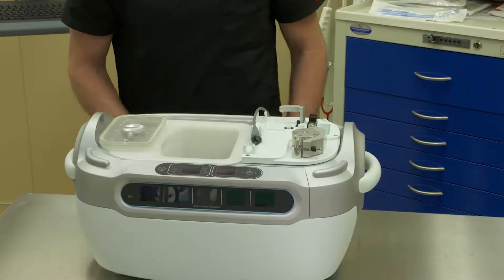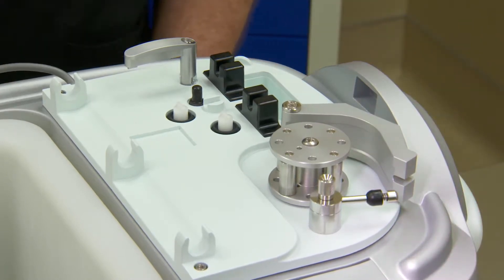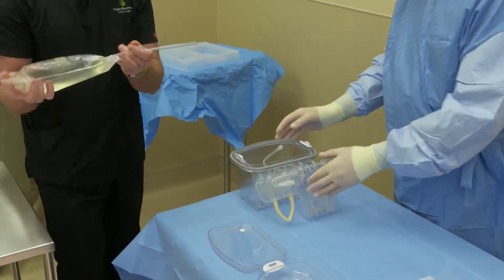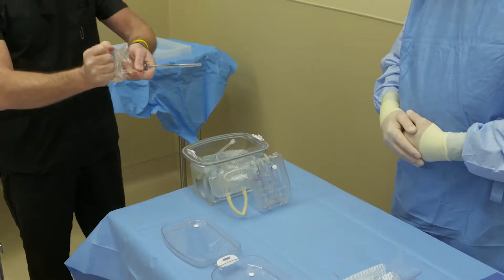A non-sterile person will then prepare the Lifeport Kidney Transporter to receive the perfusion circuit by opening the spring latch arm, tubing raceway, and locking arm. The sterile person on the field will then place the perfusion circuit on the edge of the table in preparation to receive one liter of KPS-1 preservation solution.